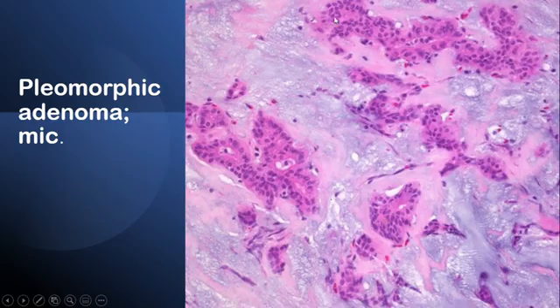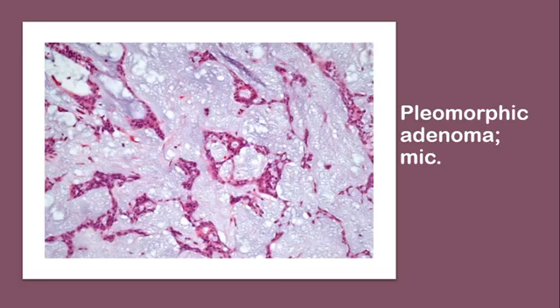So epithelial cells of the parotid acini, myoepithelial cells surrounding the excretory ducts, and the stromal elements including myxoid element, chondroid element, and even sometimes ossification with bone formation. So pleomorphic indicates multiple origins or multiple types of tumor cells within the same neoplasm.